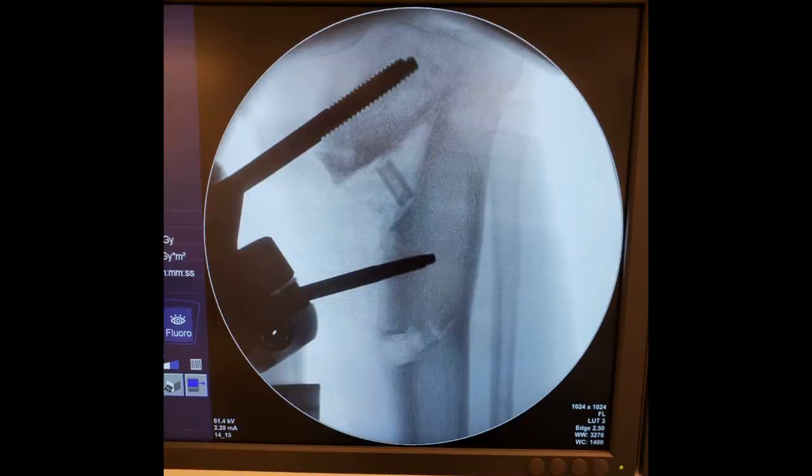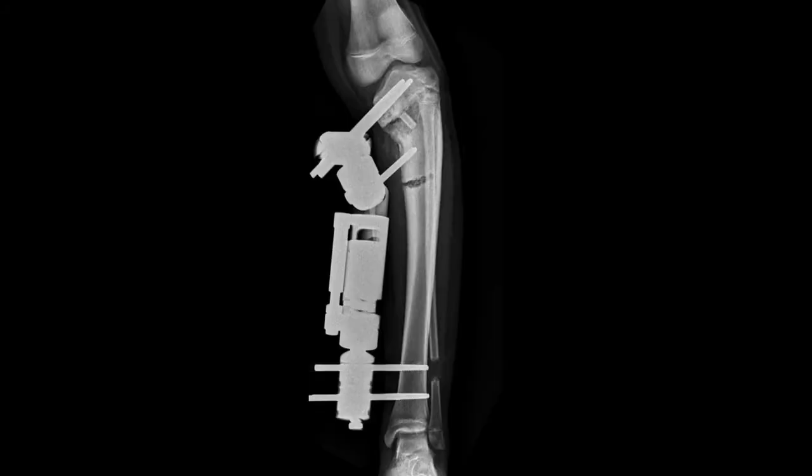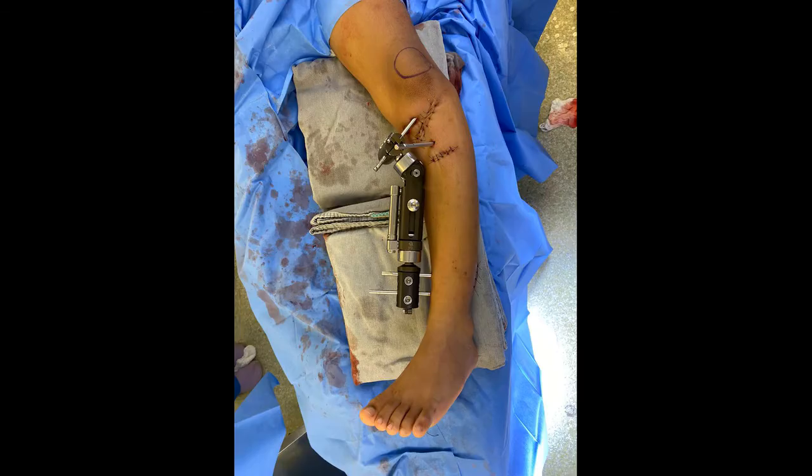We then use the L-shaped key and open the second osteotomy about 1.5 cm. We compress the distractors as much as possible, and the surgery is completed.